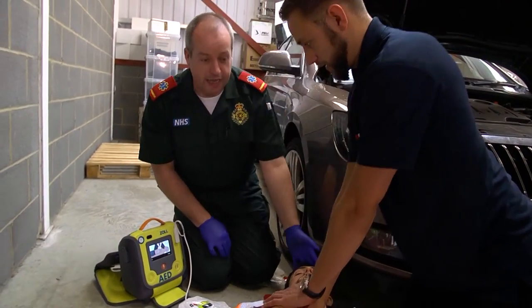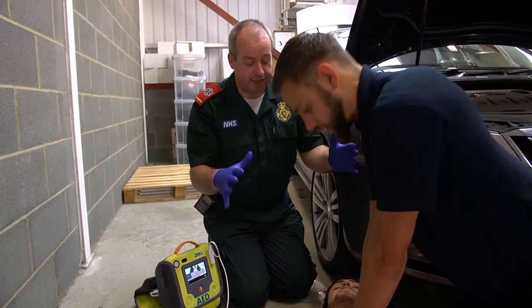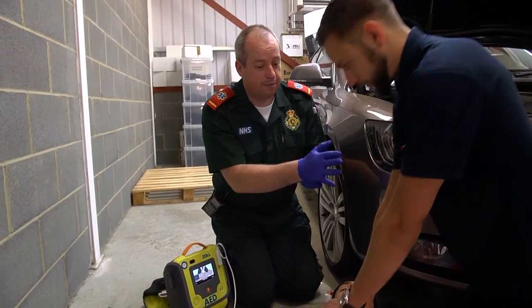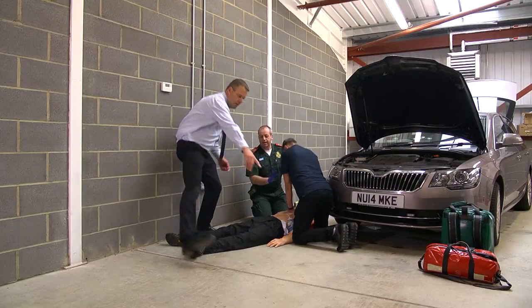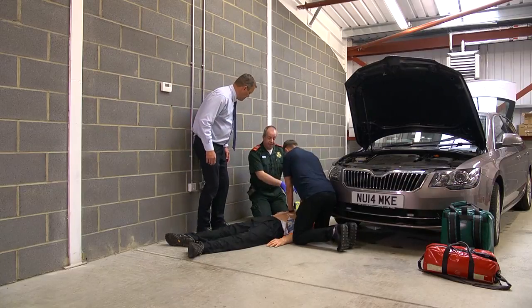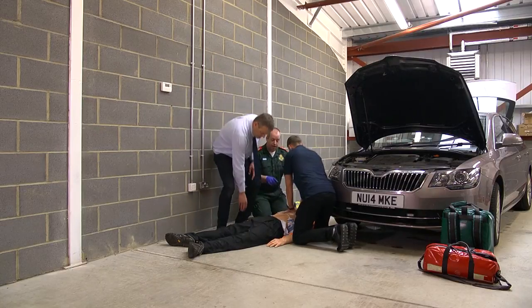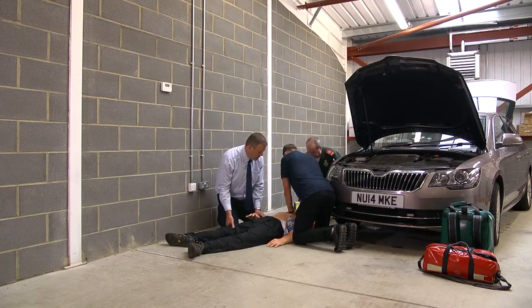That's brilliant. Okay, guys, we can't really work in this environment. So what I'm going to do is to get, with your help, to move him into the middle of the room. Sure. If we aim for getting his head on that line. This one here? Yes, facing in that direction. So his head's at the top, feet at the bottom. Yeah. If I take hold of his head and I'll keep the monitor and you two either side, if we get ready, but don't stop until we're actually ready to move. Okay.